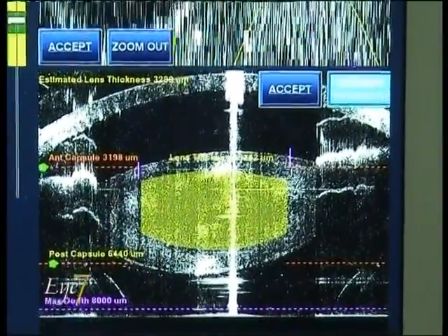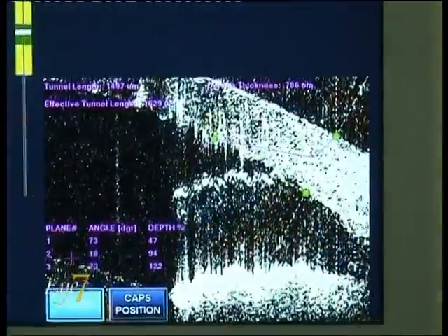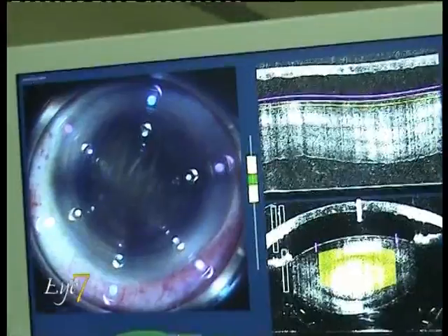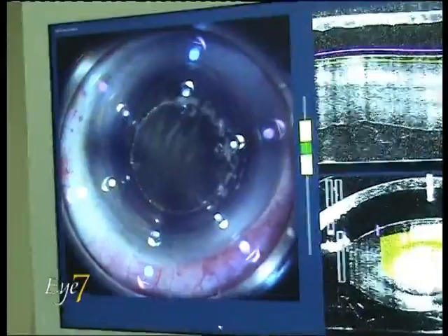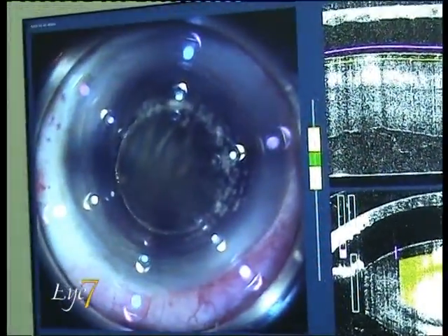Once we get the depth in position, we accept the data and move to the incisions. The incision marks — the anterior and posterior, seen as green spots — are already in place. This is a triplanar incision, and then we press the foot pedal.